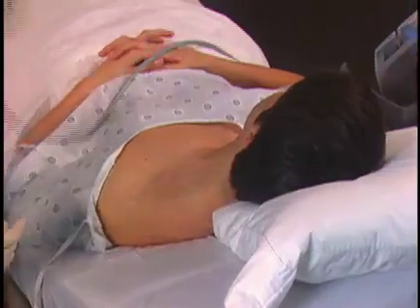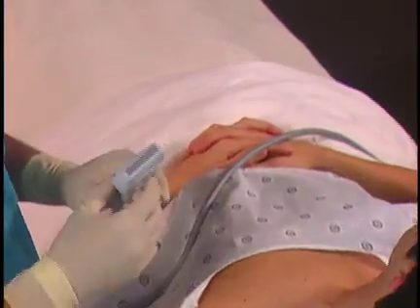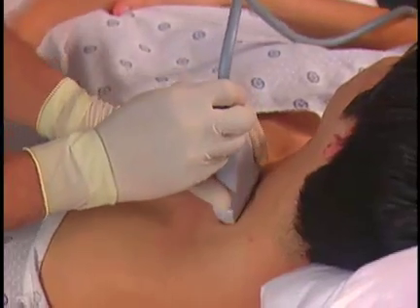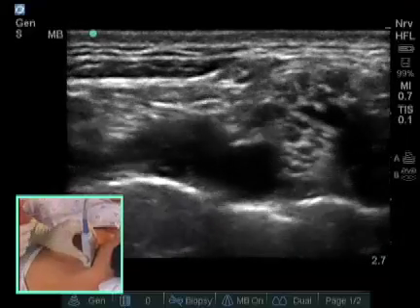We use a high-frequency linear probe for the supraclavicular block. Our nerves should be found a half a centimeter to two centimeters below the skin. I have oriented the probe so the left side of the screen is anterior and the right side of the screen is posterior.